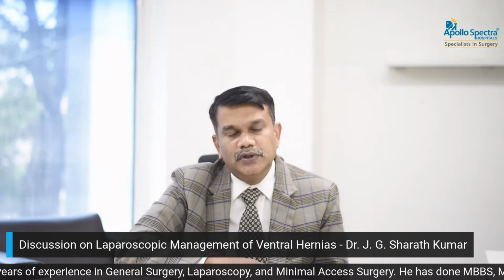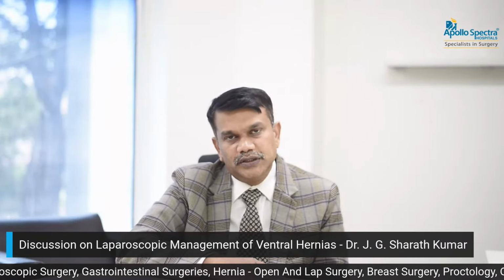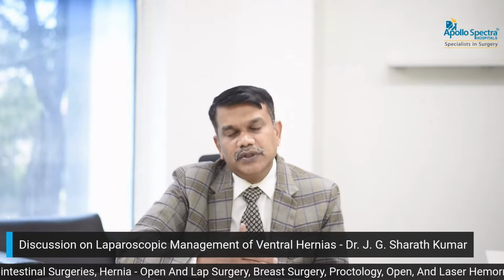After triangulation, we'll identify the defect and the contents, because sometimes it will be omentum, sometimes it may be small intestine or bowel. So after identifying the contents, first you have to reduce the contents. Following reduction of the contents, you have to dissect the sac also. Sometimes you have to excise the sac. Following which, the defect will be closed using intracorporeal sutures, barbed sutures, or sometimes extracorporeally. It's called shoelace technique. So after closure of the defect, you have to place a mesh.